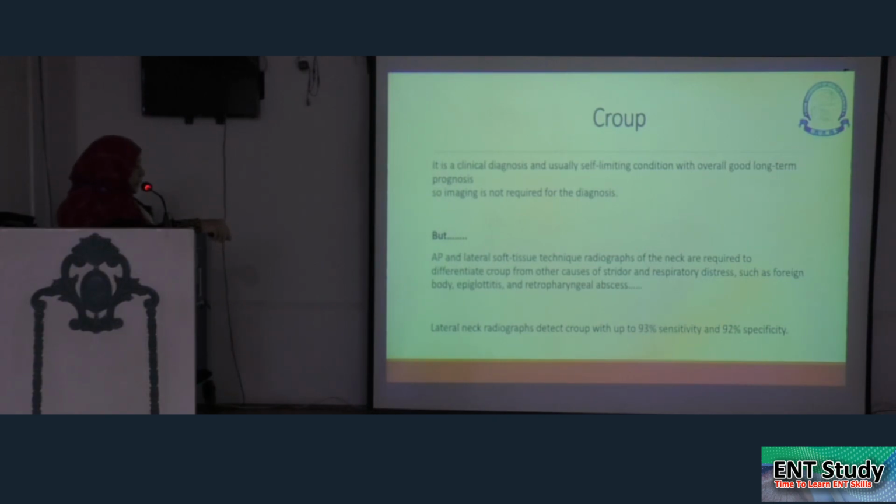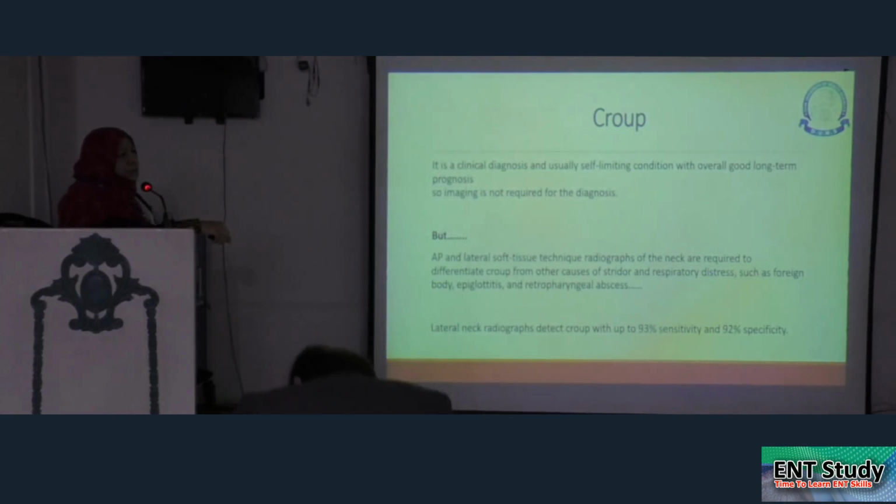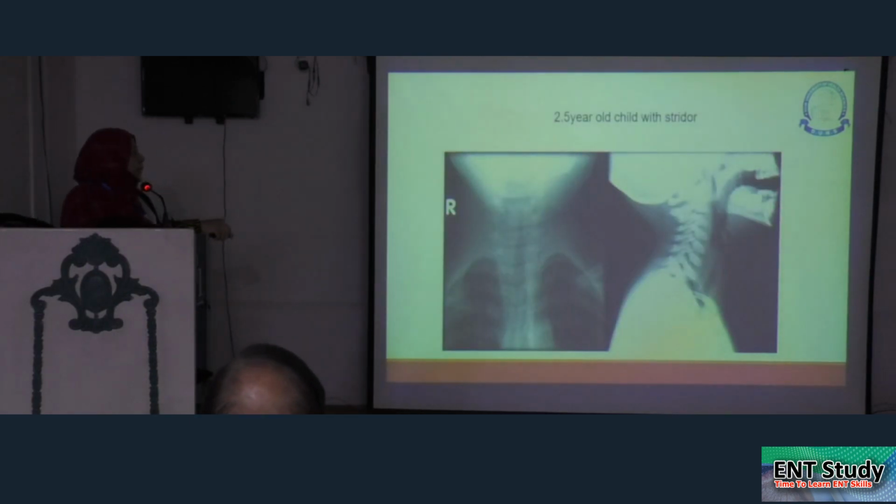The lateral neck radiograph detects croup with up to 93% sensitivity and 92% specificity. The steeple sign on the AP view does not have a high sensitivity, because it is also seen in cases of epiglottitis, and in some cases of croup this sign cannot even be detected.